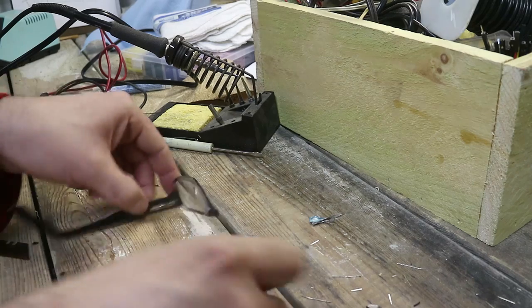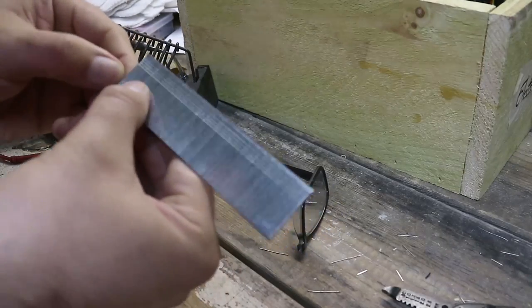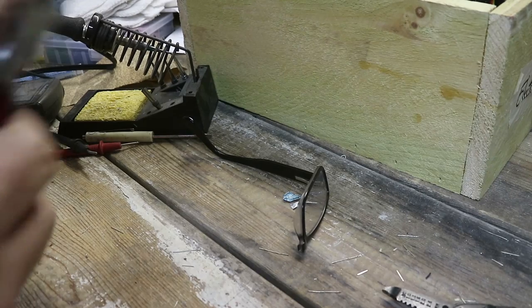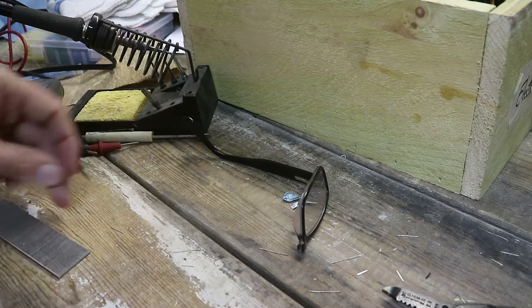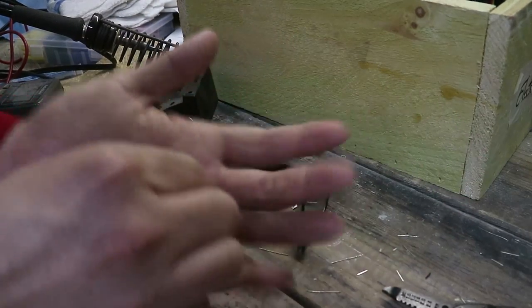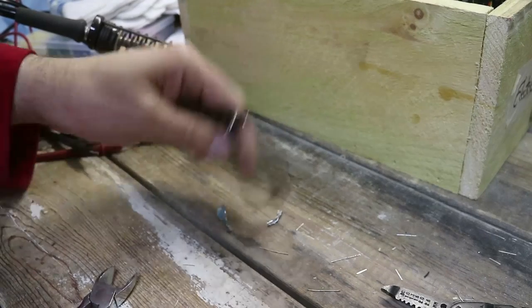Now I could do the nerd tape, but I'm actually gonna try to reinforce them a little bit. So let's do that. My current plan is to drill them out and use a brad nail as a reinforcement and some super glue or maybe some epoxy to hold them all together. I think if I can get that guy in there, then I'll get a chance of these actually staying together until I can get a new pair. They're about 2 years old anyway, so I need to go get a new prescription and a new set.